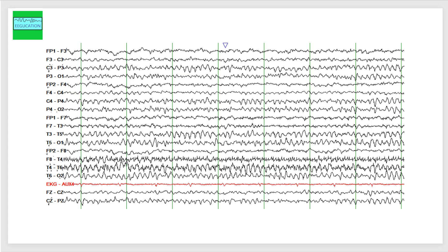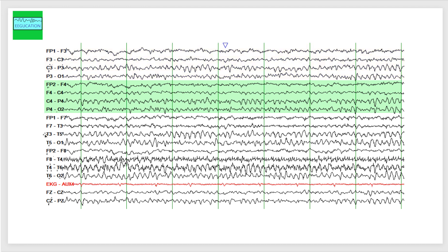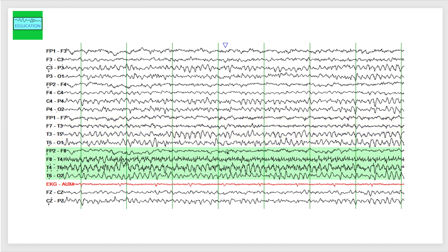This is the EEG. I want you to try to see if you can identify if there is any asymmetry between the left and the right hemisphere. Carefully look at the left parasagittal contacts here, then look at the right parasagittal contacts, see if there is any difference. Number two, look at the left temporal contacts and look at the right temporal contacts. Something that you will notice is there is more abundant high frequencies and slightly higher amplitude in the right temporal head region, and this is most likely related to the craniotomy.